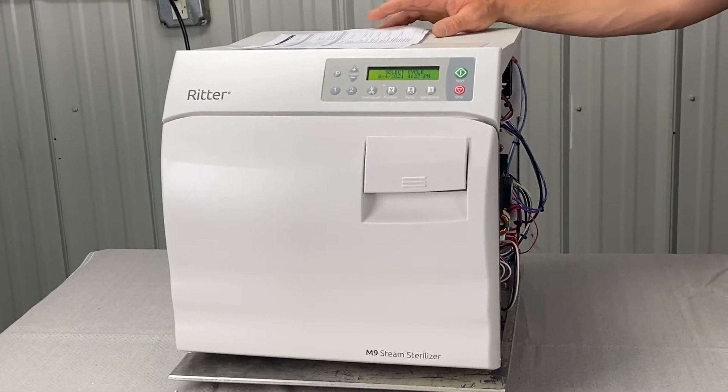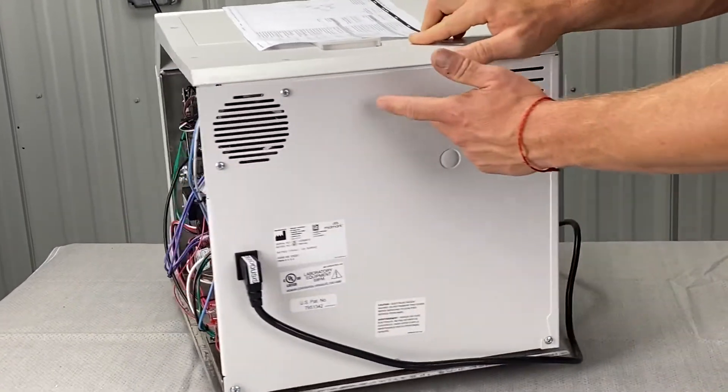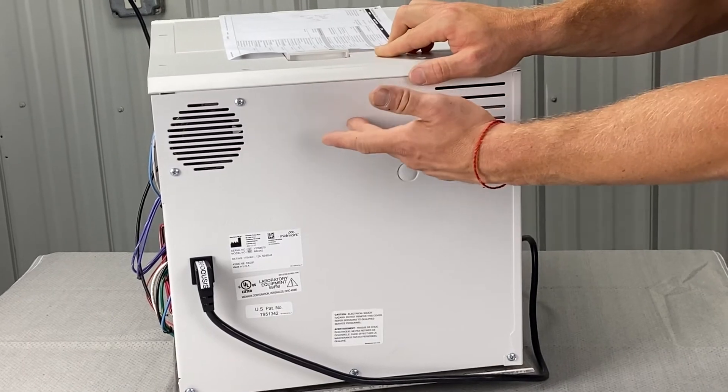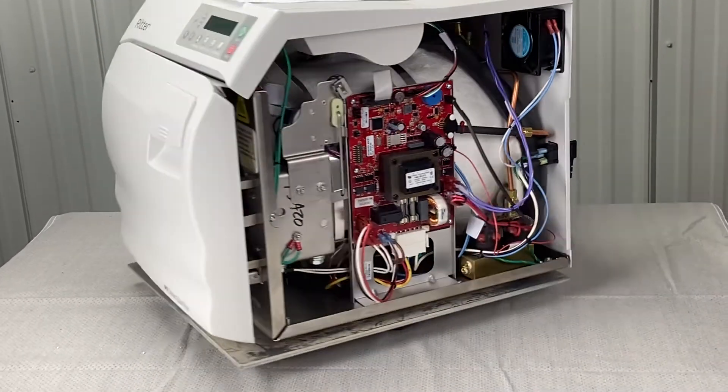There are gaskets and a fitting under there. It could also be a defective air valve — there's an air valve in the back, and it could be bad, clogged, or corroded. There are further steps for that, so give us a call before you proceed — you'll need some specific tools: pressure relief valve, pressure transducer, and tubing connections.